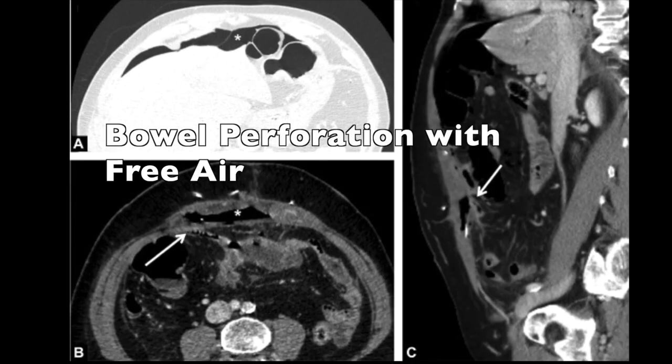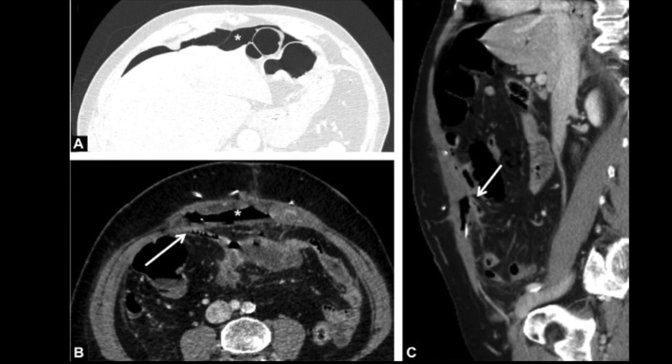Here's a case of small bowel perforation. This patient developed sudden pain a few days after abdominal wall repair using an intraperitoneal mesh, VentralEx. We see free air around the liver and close to the abdominal wall. Small bowel loops shown by the arrows are located adjacent to the abdominal wall. During surgery, two tiny holes were found in bowel loops.